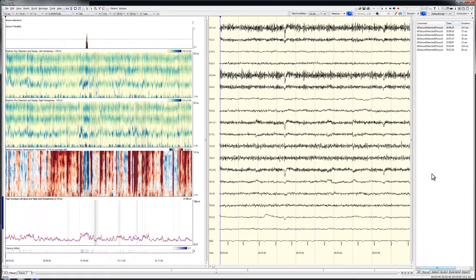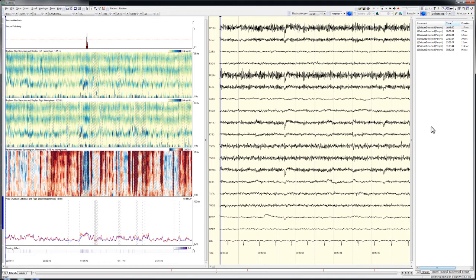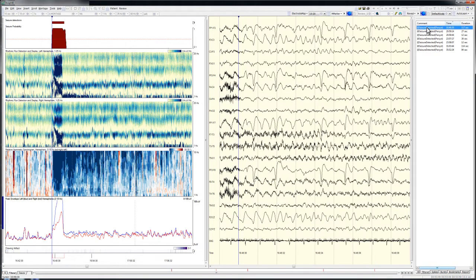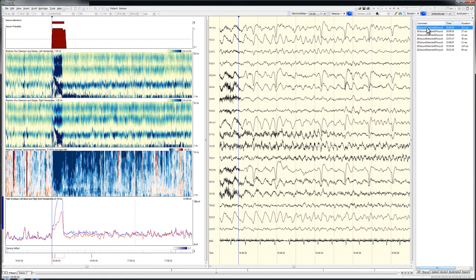Let's start the EEG review. Whenever I click on the screen, a small ring will appear around the cursor. I click on the first seizure detection listed in the comments section. This causes both the EEG page and the EEG trending graphs associated with that detection to appear on screen. The bipolar longitudinal EEG shows a pattern consistent with the left hemisphere's predominant seizure.